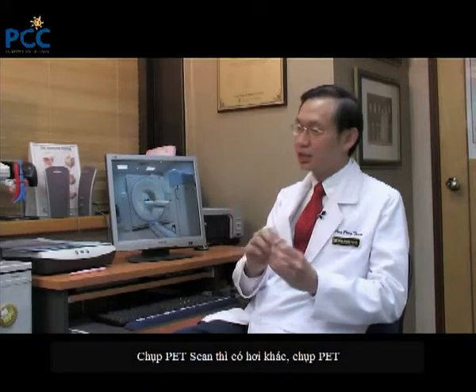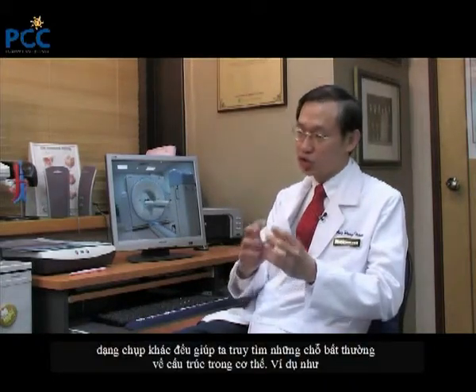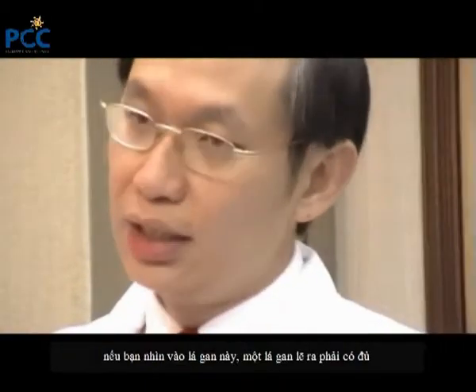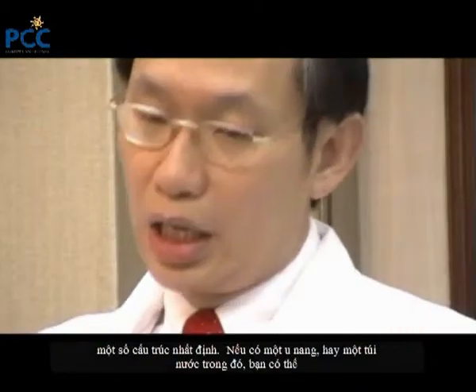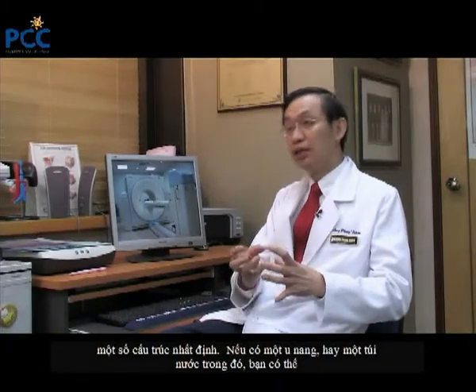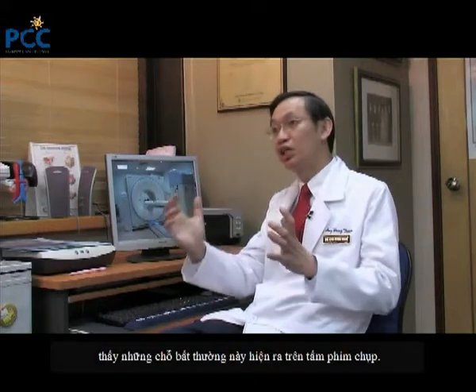The PET scan is a little bit different. The PET scan is different from all these other scans because all the other scans are looking for structural abnormalities. For example, if you look at a liver, it is supposed to be of a certain consistency. If we find a cyst, a bag of water in it, you can see the abnormalities in terms of the way in which the image appears.